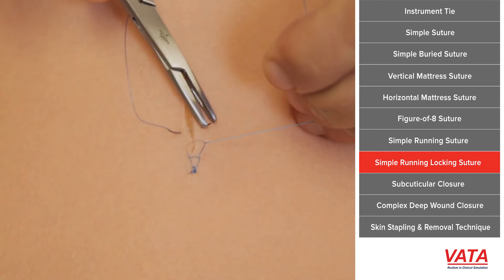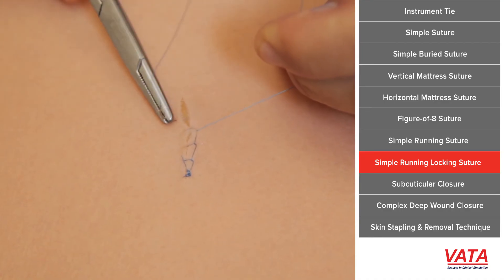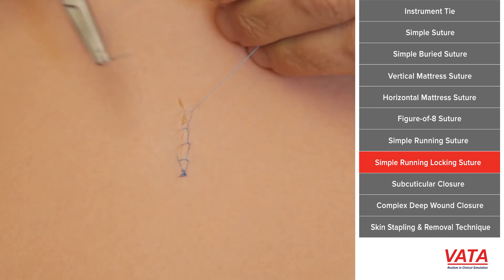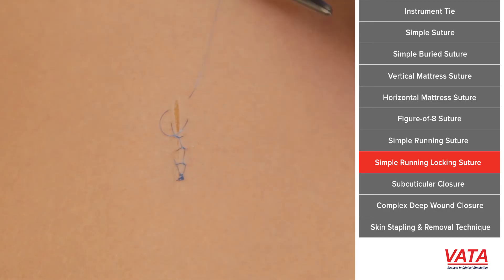What you see here is that you can do a pretty long suture line and not worry about it untying behind you as you go. It probably adds more suture to the skin, so it's not as good necessarily for cosmesis, but certainly for something like bleeding — like in a scalp wound — or when you're just trying to get something closed quickly, it works perfectly.